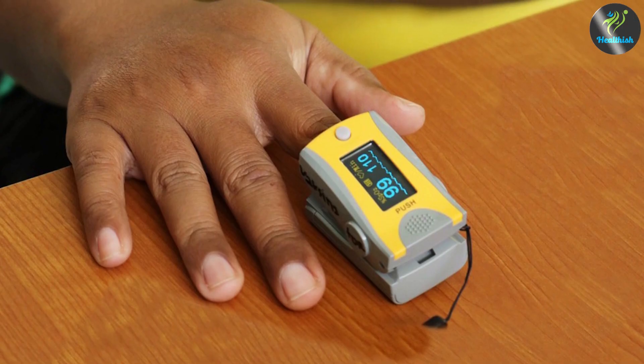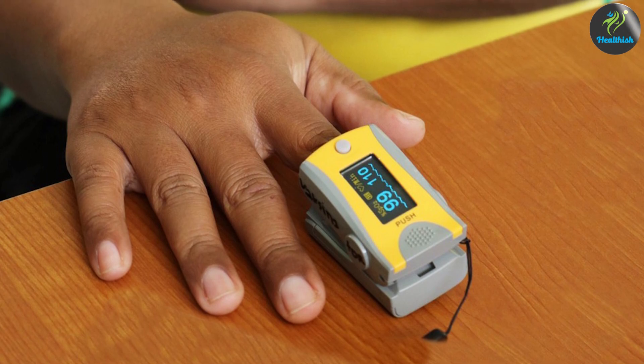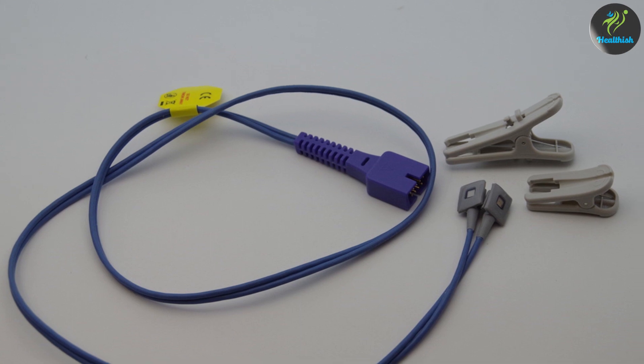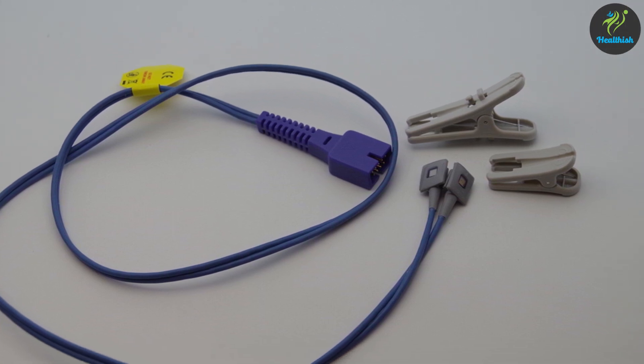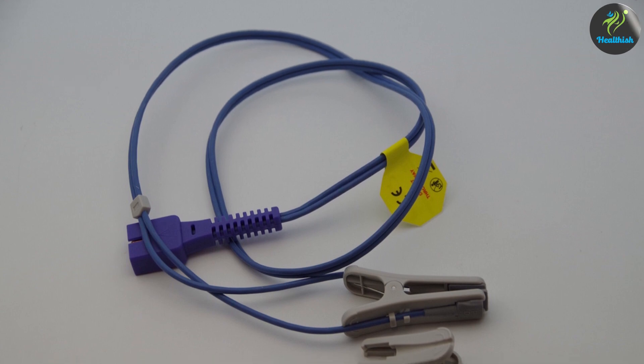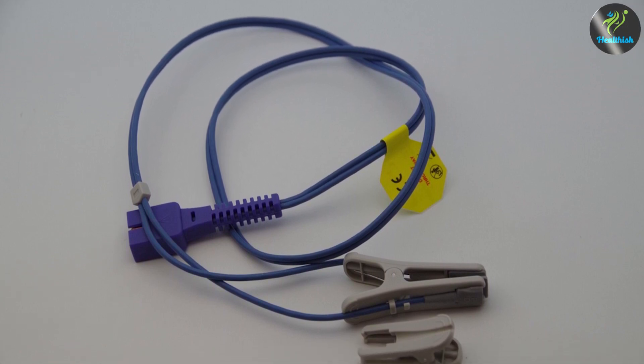Before concluding, let's discuss a few considerations when choosing between ear and finger pulse oximeters. Finger pulse oximeters are widely available, cost-effective, and suitable for most individuals. Ear pulse oximeters, although less common, may provide a viable alternative for specific situations. It's important to choose a pulse oximeter that meets your specific needs and consult with a healthcare professional if necessary.